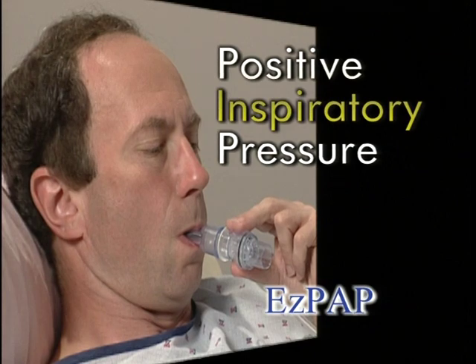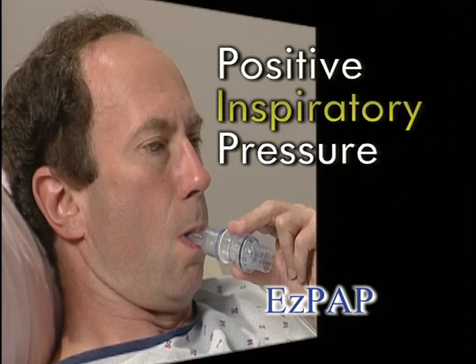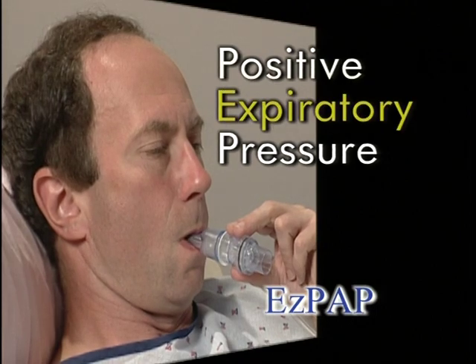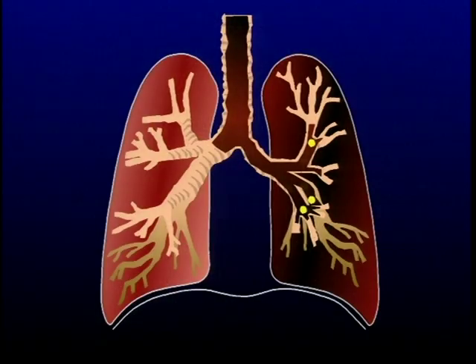The expiratory resistance provides PEP therapy to further splint open the airways and reinflate the alveoli through collateral ventilation. With EZ-PAP, the patient receives a positive pressure inspiratory assist when inhaling, their breath hold is positive pressure, and there's a positive expiratory pressure, PEP, on exhalation. The goal of using EZ-PAP is to assist the patient in opening the airways in their lungs.